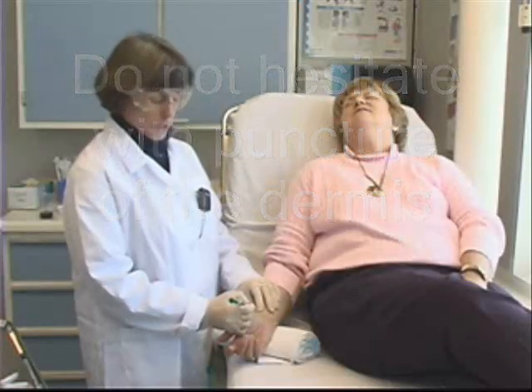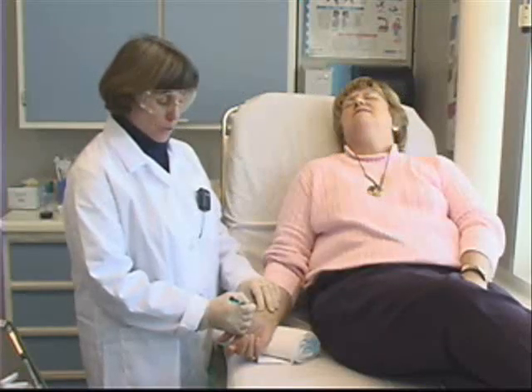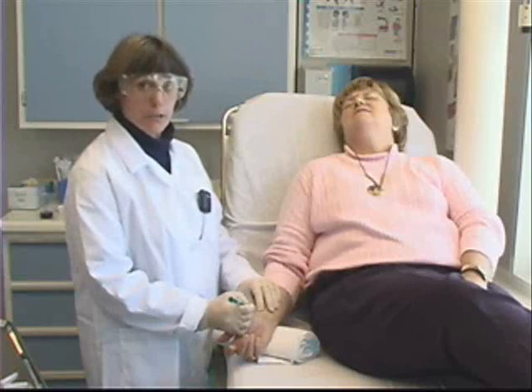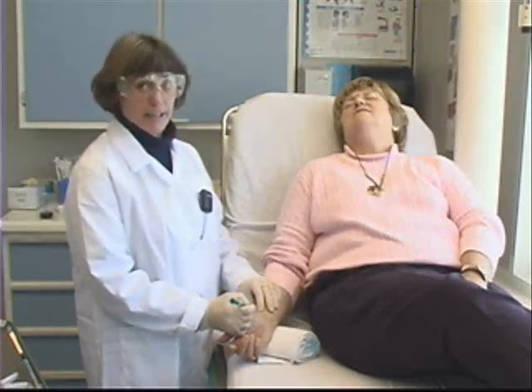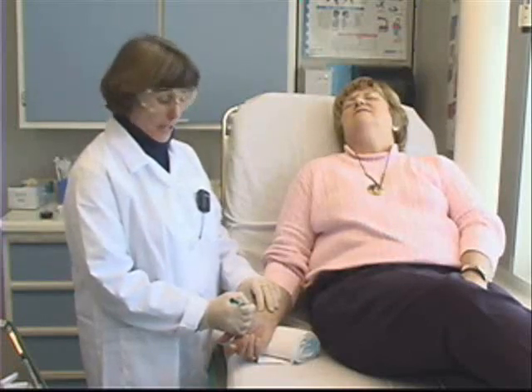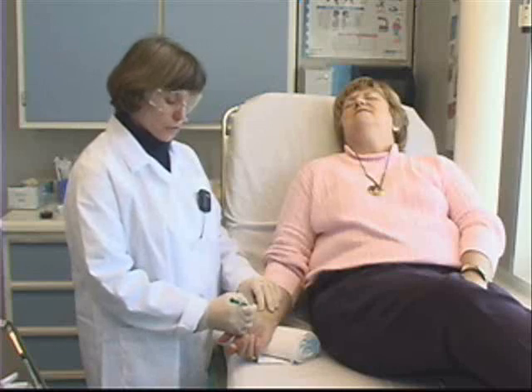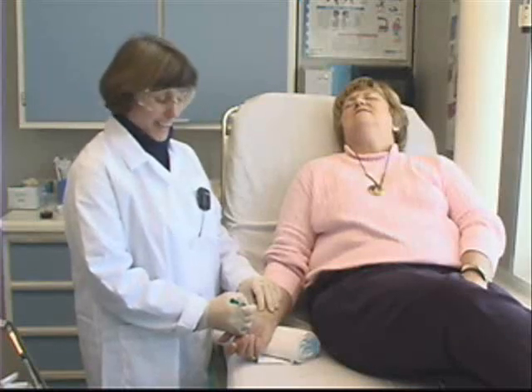Once I've put the needle through the skin, I next watch for a flash of blood into the hub of the needle. This tells me that I've accessed the artery. Once I've done that, I can watch for the blood to pulsate back into the syringe.